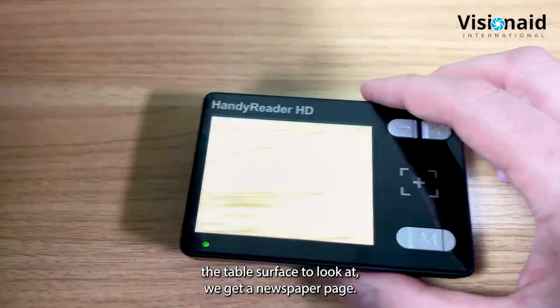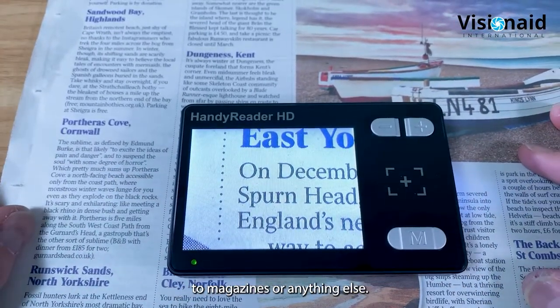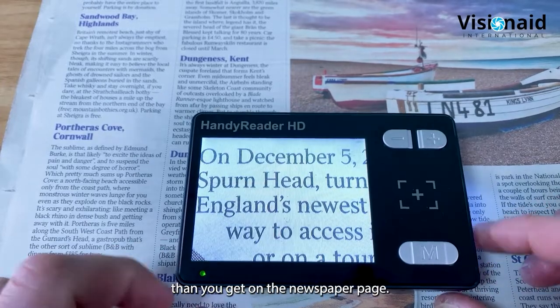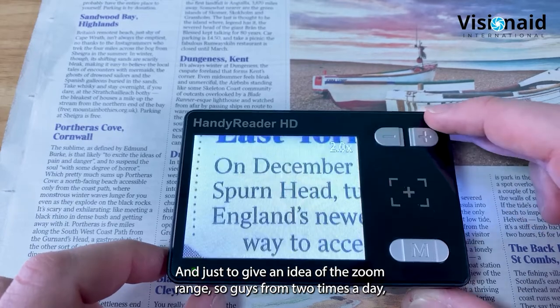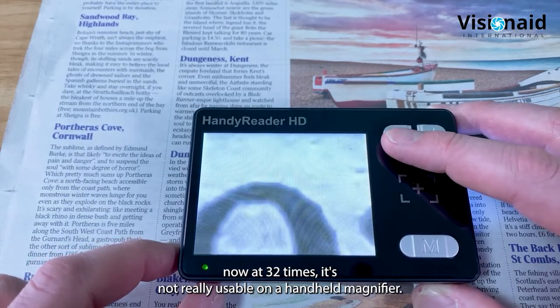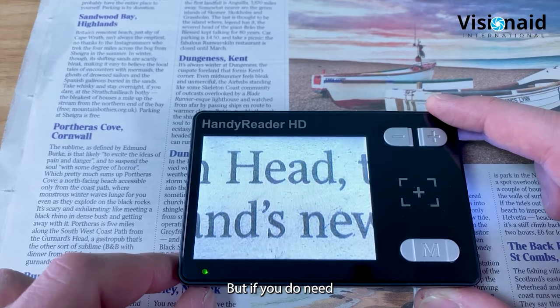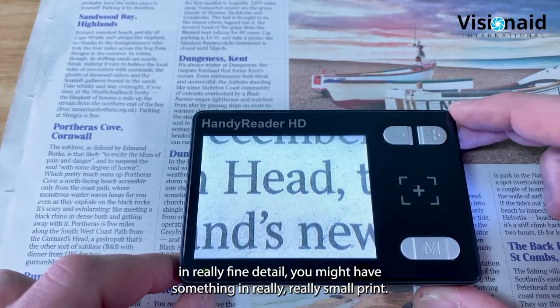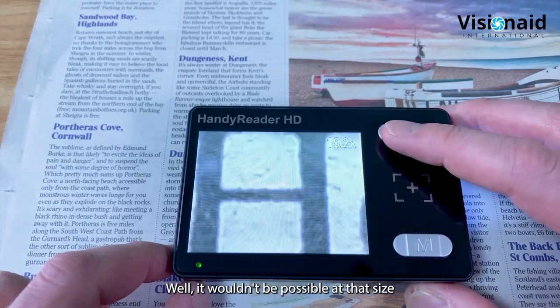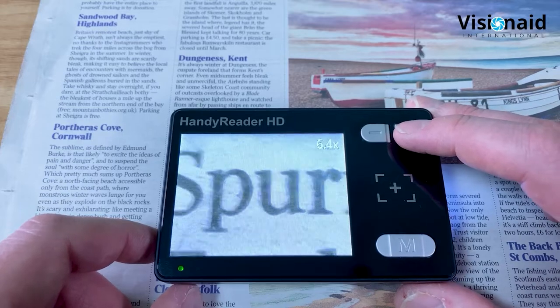Newspapers tend to have the worst quality print, so they're a good test. You can see immediately it's much larger text. The zoom range goes from 2 times all the way up to 32 times. At 32 times it's not really usable on a handheld - for that level of magnification it's not the right product. But for examining very fine detail or very small print it could be handy. Being continuous zoom, you can get it to exactly the size you need for your particular eye condition.